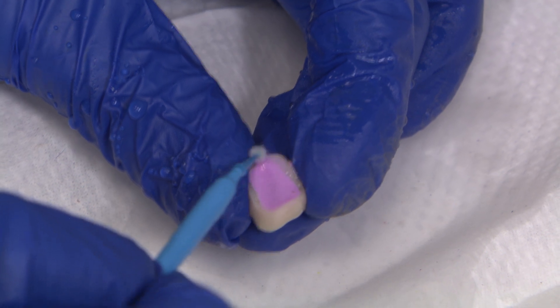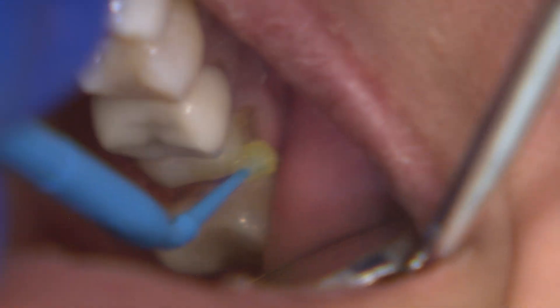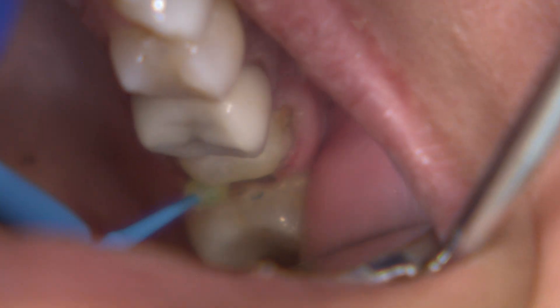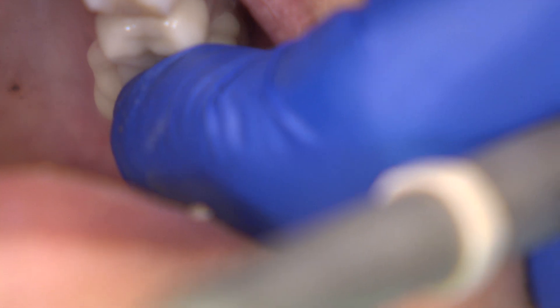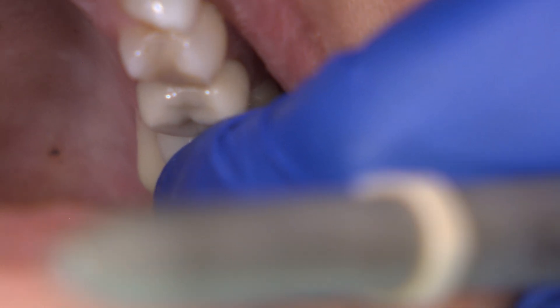IvoClean is used to remove salivary phosphate contaminants that inhibit successful cementation for zirconia crowns. Monobond is placed on the internal surface of the crown to enhance the bond between the cement and restoration. I use a bonded cement protocol with Reliax Universal, which is great for retentive and non-retentive crowns.